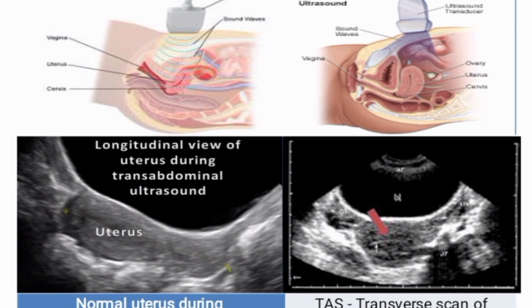When your patient is properly oriented, these are the images you see, and there's a schematic diagram to give you an idea of organ relationships vis-a-vis the probe placement. These are the four directions in sagittal transabdominal scan images, with respect to the current AIUM standard.